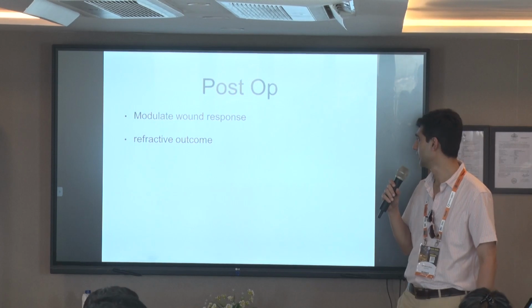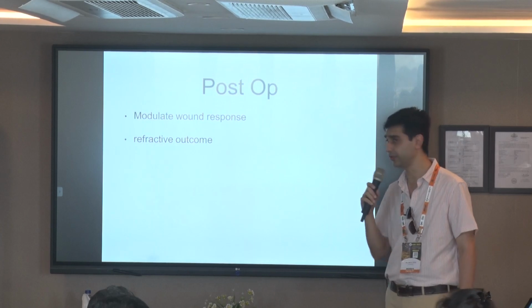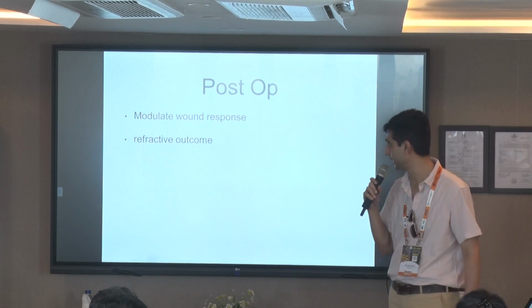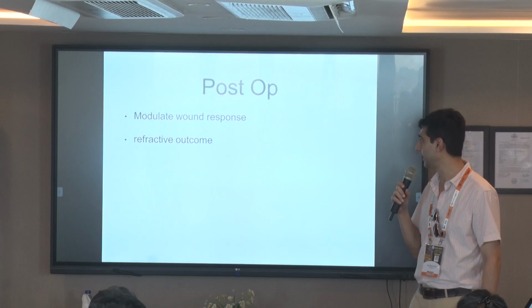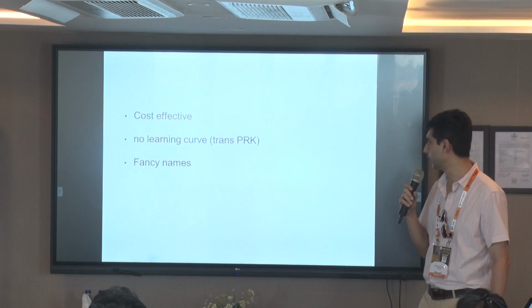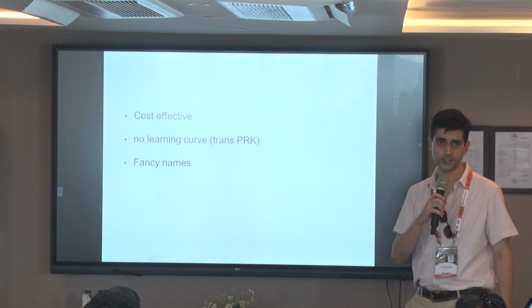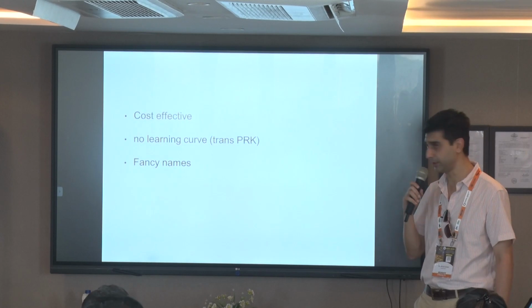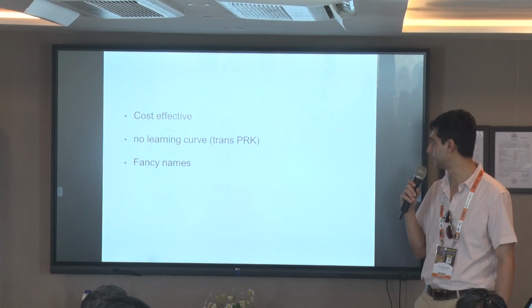And in the post-op, definitely, if there is an overcorrection, we can modulate the wound response, which is not possible in a case of Lasik, by stopping your steroids and starting an NSAID. And that way, we can modulate the refractive outcomes too. And then finally, it is a very cost-effective way of doing it. The only cost would be the gas exchange which you take, and then you can do as many procedures as possible without any recurring costs of the LASIK surgery.